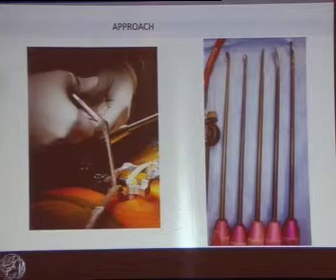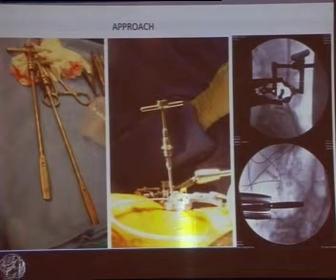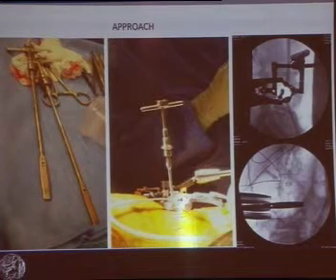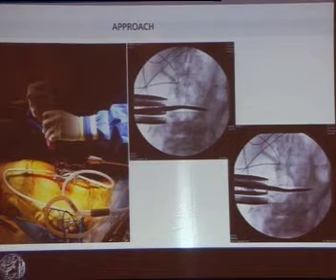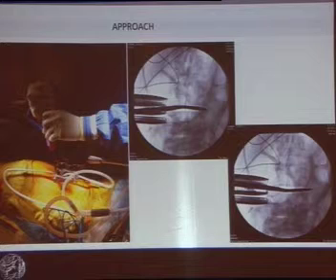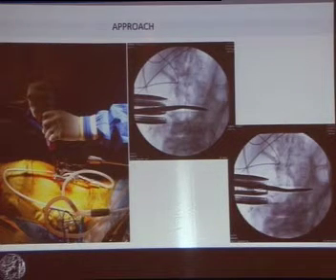the bony end plates, especially in osteoporotic patients. Successful removal of the disc is followed by release of the contralateral annulus in order to provide enough space for wide cage placement.